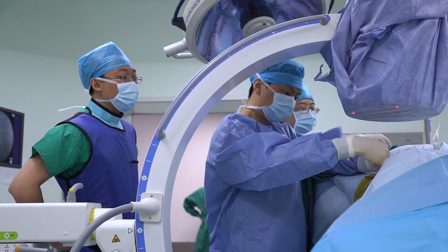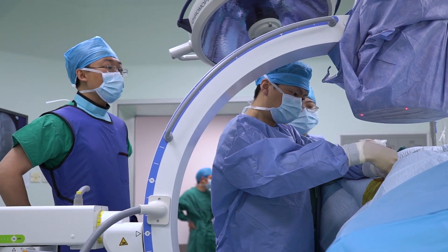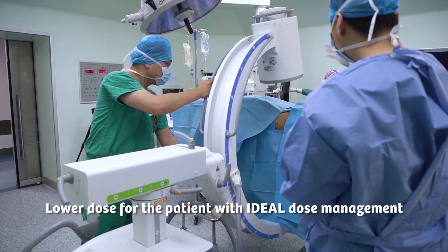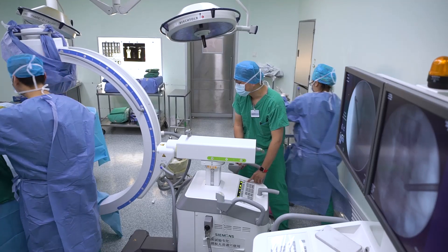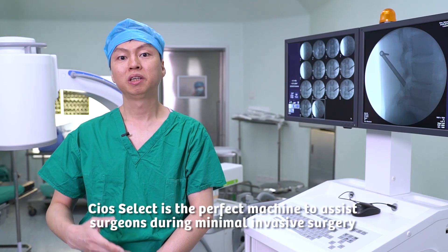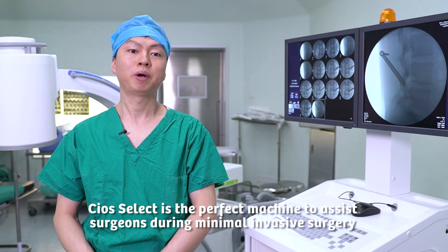The dose we give to the patient should be lower. So this kind of machine is also very light, easy to move, and with low dosage exposure to the patient. If we choose minimally invasive surgery, we have to use this kind of equipment to help us.